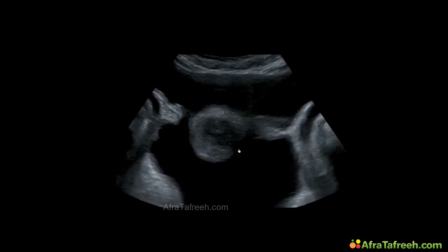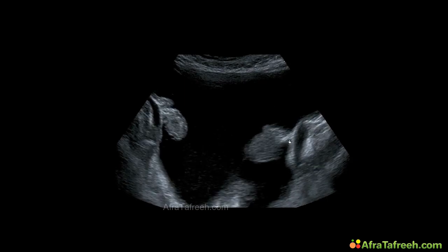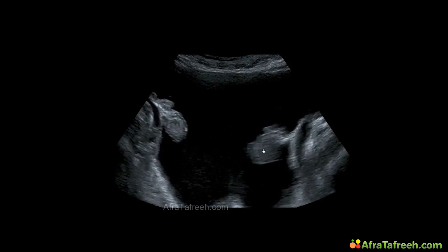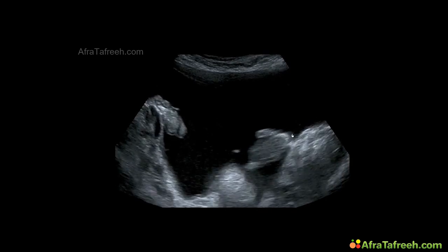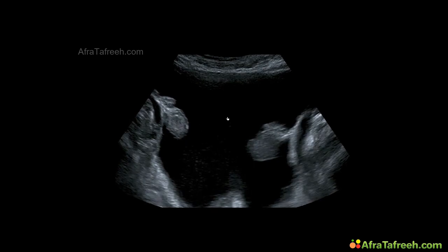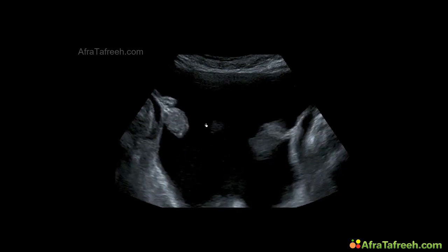When we scan the uterus in a transverse mode, we can easily detect the ovarian tissue on the right side and on the left side, and the uterus hanging in between the ovaries, connected with the ligament to the iliac fossa of the left and right lower female pelvis.